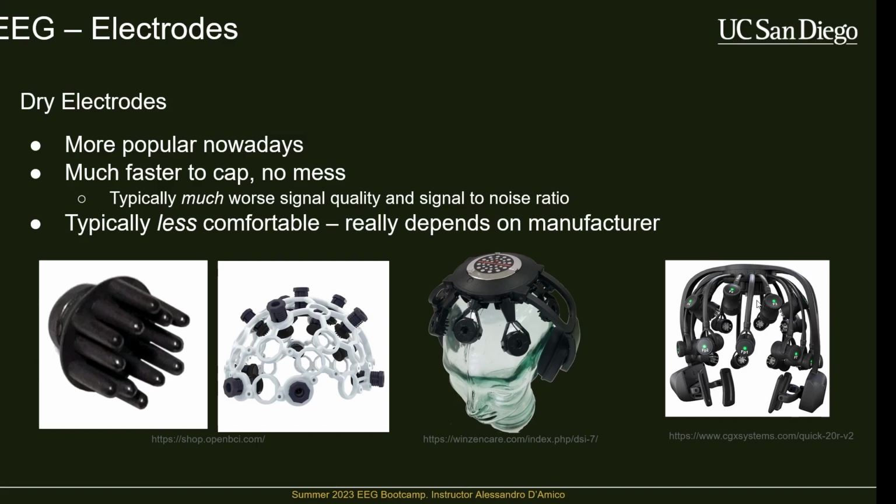But like Cognionics, which is a company in San Diego, they make a lot of dry headsets. These things really, really suck. They hurt. The OpenBCI dry headsets, I have actually gotten scabs that have lasted multiple weeks on my head from putting these on. Anybody who's done significant tinkering knows that these are actually horrible.